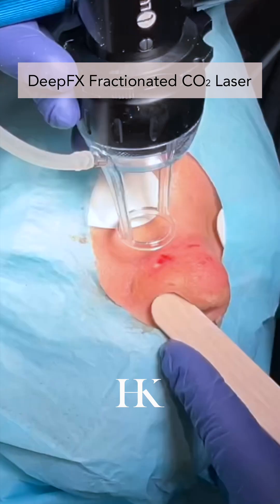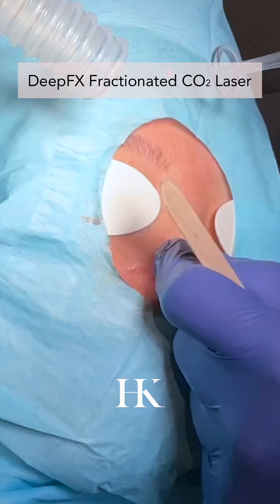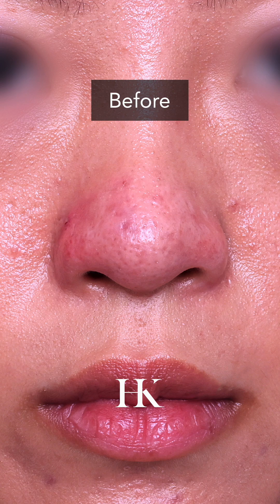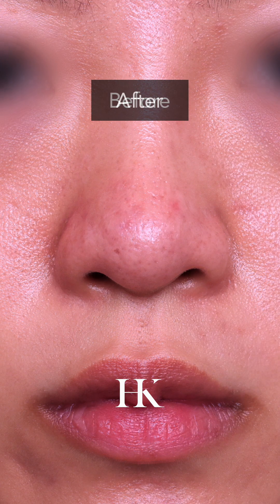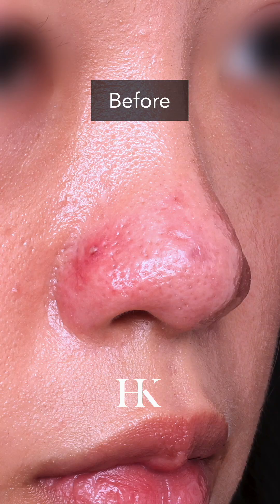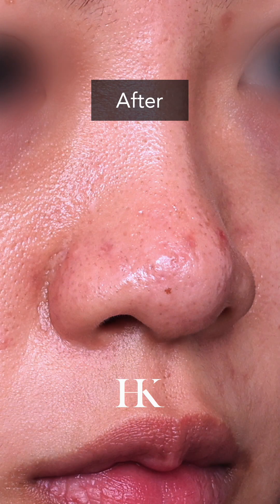Finally, we're using a fractional ablative CO2 laser. This allows us to go a little bit deeper to get the roots of those same glands at the deeper level. Here are the patient's before and after photos. Thank you so much for watching — this is Dr. Korasani.